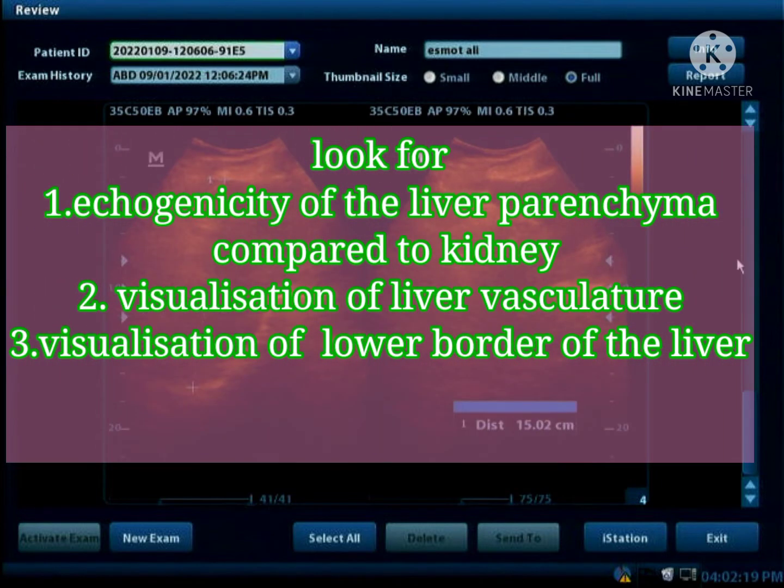During diagnosis of fatty changes of the liver, we look for three things: number one, liver parenchyma echogenicity, which is usually compared with the kidney parenchyma; hepatic vessels; and the lower border of the liver.